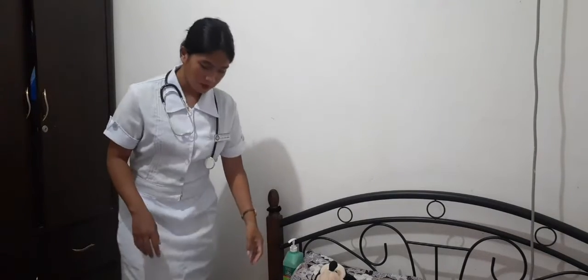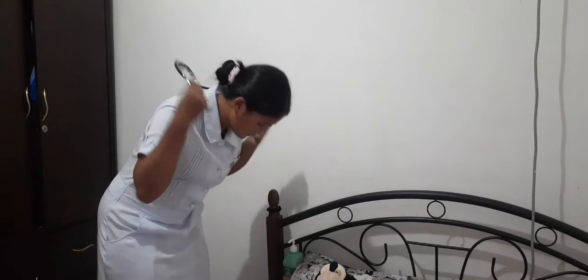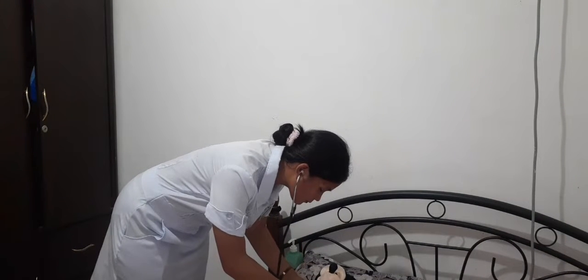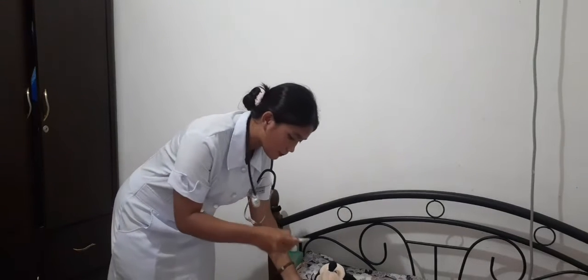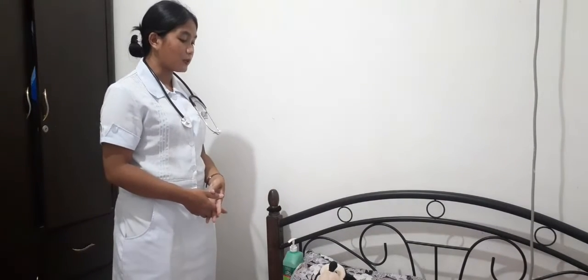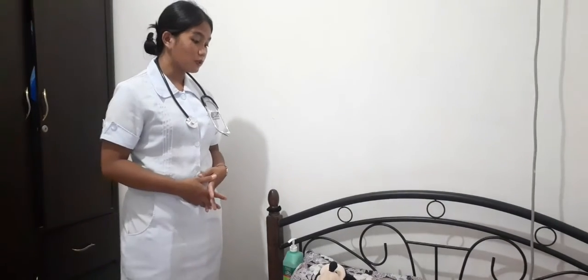And before we start, I'm going to check your vital signs. So we're going to check your temperature and your respiratory rate. Okay, so your respiratory rate is in normal range and your temperature is normal. Okay, so how about your pain? How much will you rate your pain from 1 to 10, with 10 being the highest? Okay, 3. Thank you. So let's proceed.